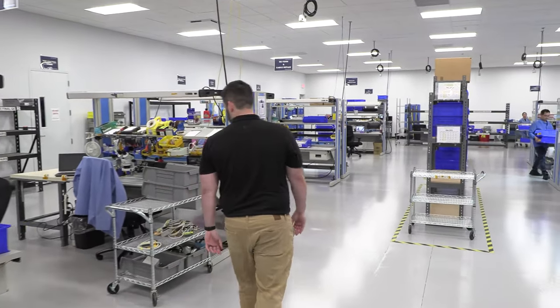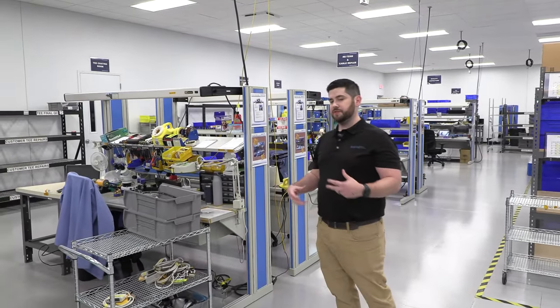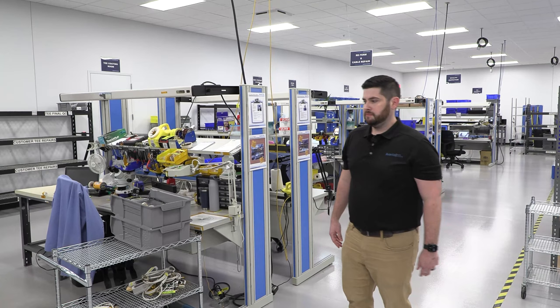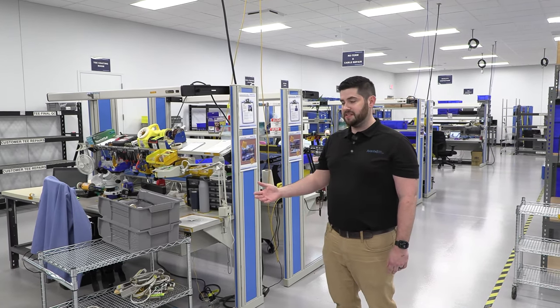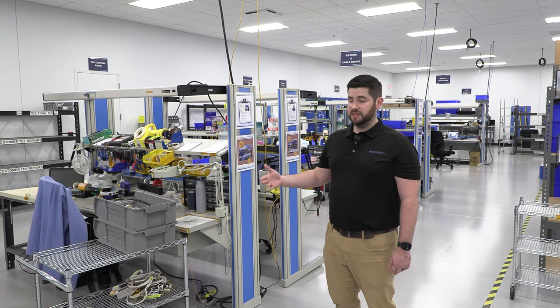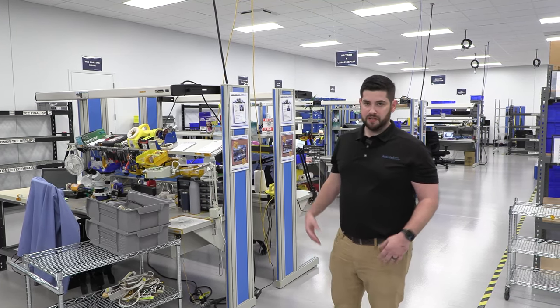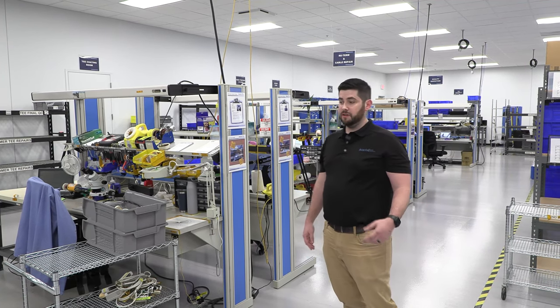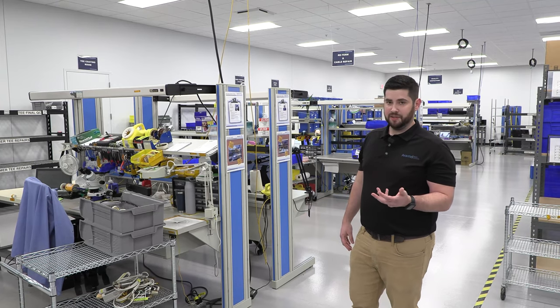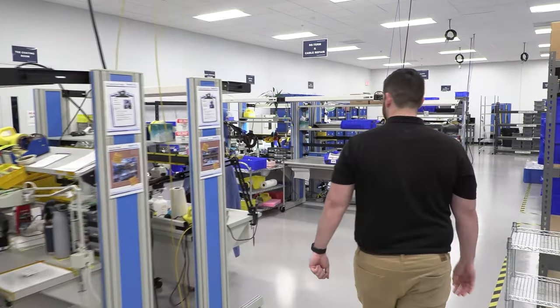And we also still do some of the older TE probes. They're a little bit more mechanical in nature as far as their calibration. We still repair those. Most of the newer probes, like the Philips X72T and the Philips X82T, are matrix array, so there's no mechanical calibration. It's all digital. But they literally have thousands of different elements that are handled by an ASIC inside of the array. So a lot of cool stuff. That's interesting. I didn't know that.